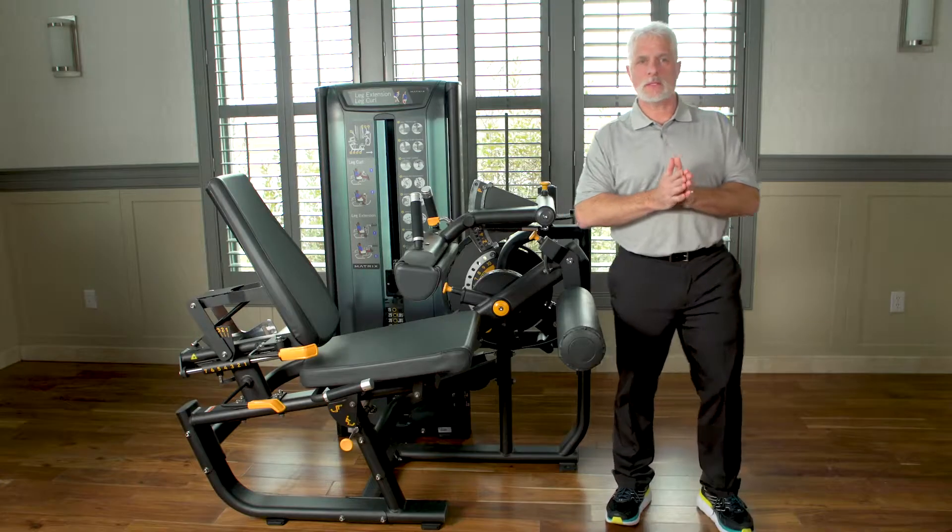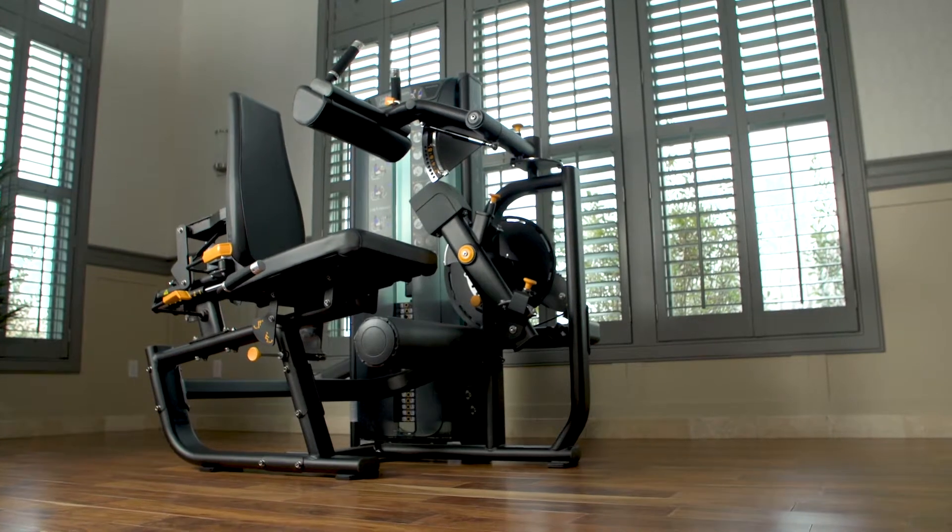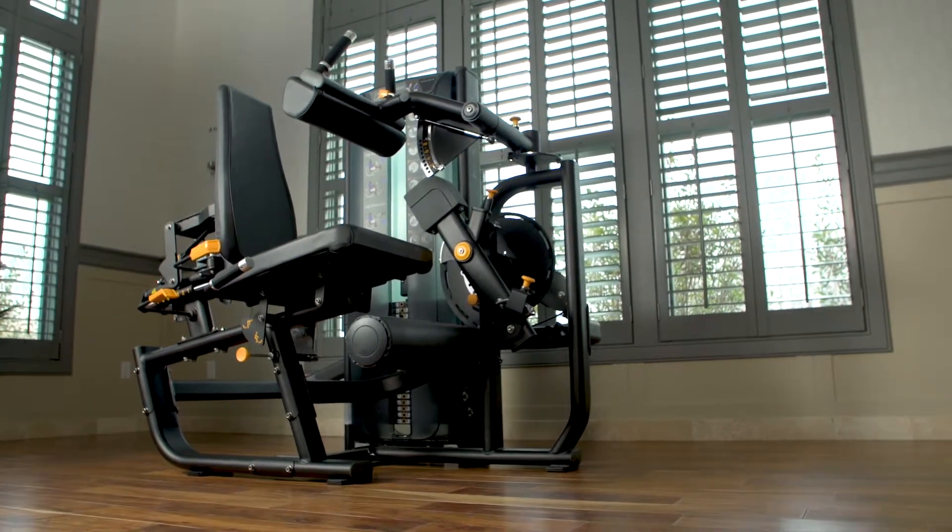Hi, I'm Dr. Scott Benjamin and we're going to talk today about the leg extension leg curl by Matrix. This machine is very unique in the sense that it provides features for the physical therapist that no other leg extension leg curl can provide.